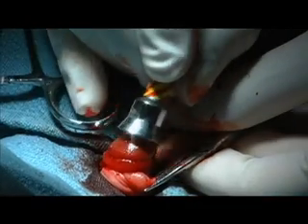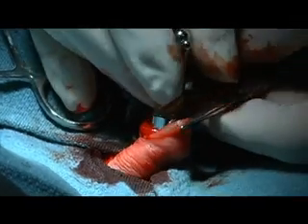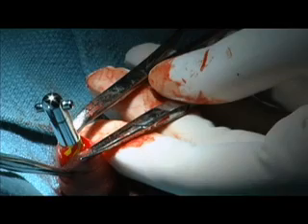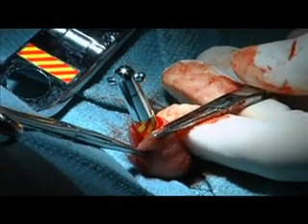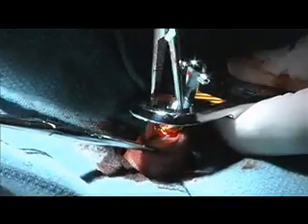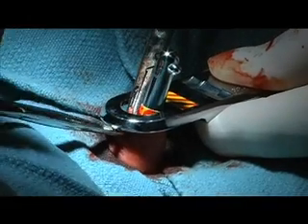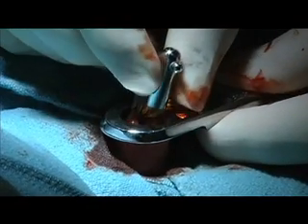Place the bell of the clamp on the glands and use a hemostat to hold the foreskin around the stem of the bell. Remove the hemostats at 10 o'clock and 2 o'clock. Insert the stem of the bell into the hole in the base plate from below. Reach down through the base plate with a hemostat and hold the foreskin around the stem of the bell. Remove the hemostat from below the base plate.